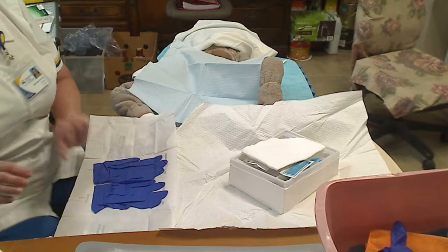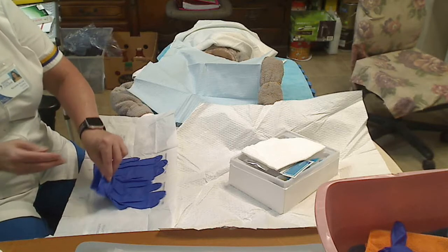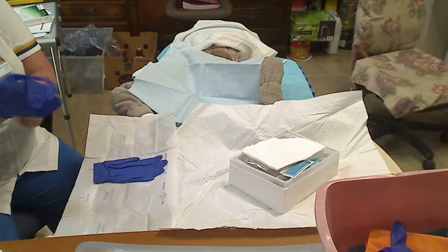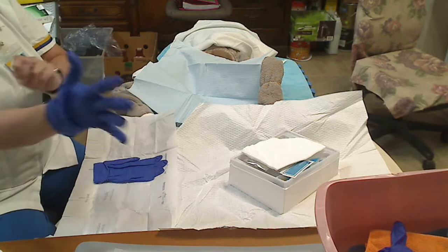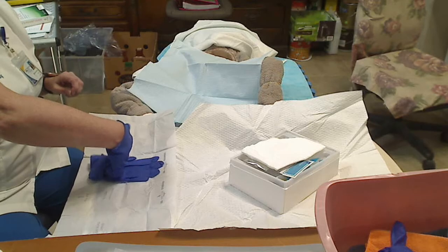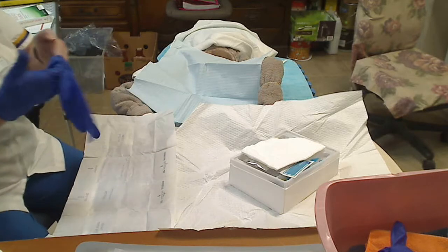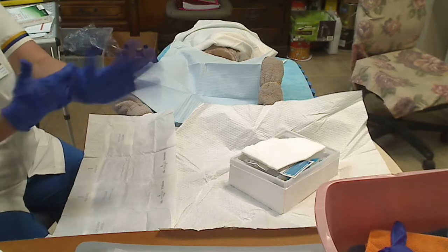Using sterile technique, grab the outer edge of it, step back, place my thumbs in, and hands on. I'm going to use my fingers to grab the inside of the cuff. I'm going to use hitchhiker thumb, make sure that my thumb does not get in the way of putting on my gloves, and put my gloves on.